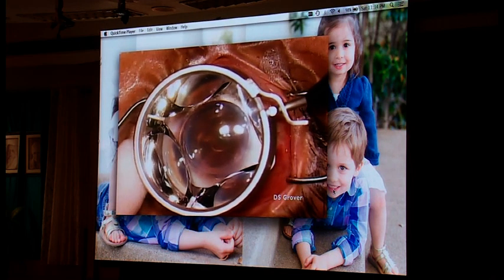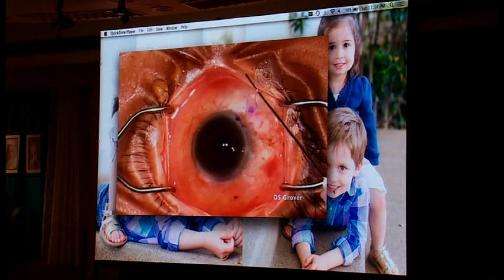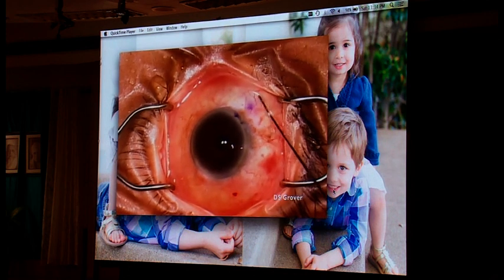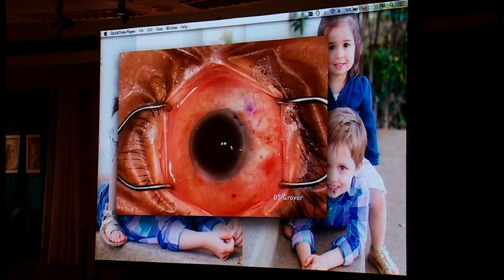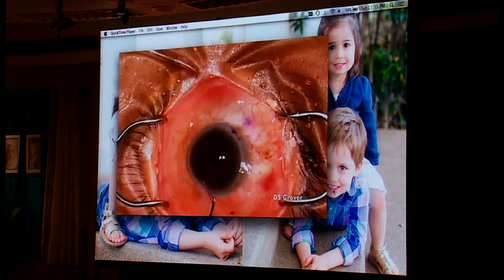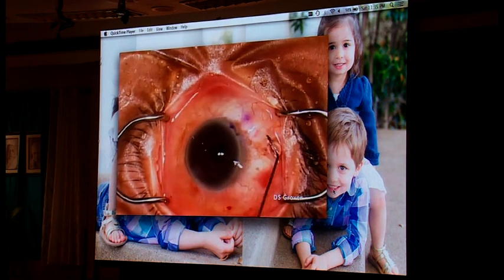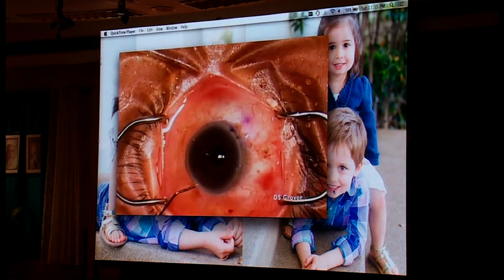And then you want to confirm implantation. You want 1 millimeter in the anterior chamber, 2 millimeters in the scleral space, that's the implant, and then 3 millimeters in the subconj space. You will see a bleb, and you want to make sure that it's straight and that you like the positioning of it. Then I'm just washing out the Healon GV, and you'll see a low bleb form. I do this under topical anesthesia. This patient was blocked, but I now do it under topical anesthesia.